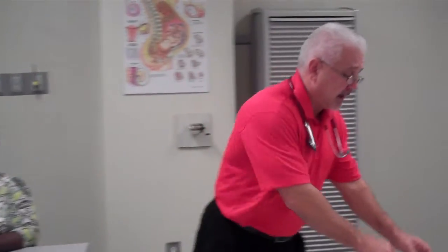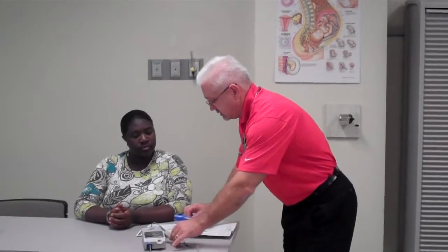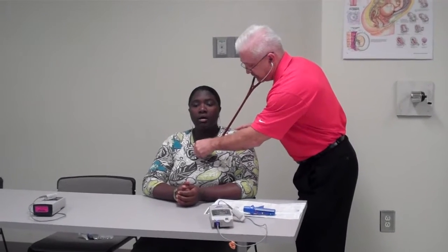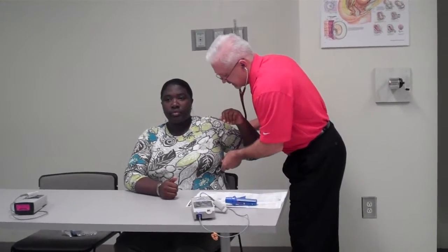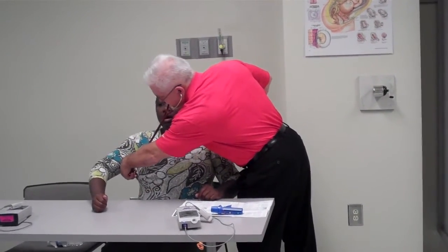At this point, I could set up my equipment, and what I'm going to do is a couple of things. I'm going to listen to her breath sounds, take my stethoscope. I'm going to ask the patient to open their mouth, take a deep breath in, and then exhale fully. And I'm going to listen to her on the front, here, and here. Okay. Now I'm going to ask her to lift her arm up, and I'm going to listen again. Okay, and one more time. And then I would listen to 4 on the back.